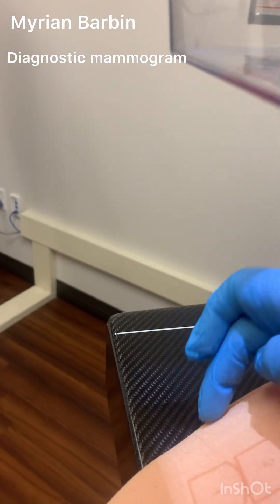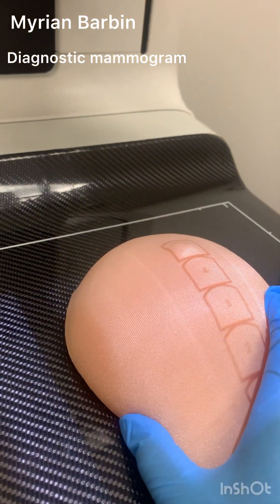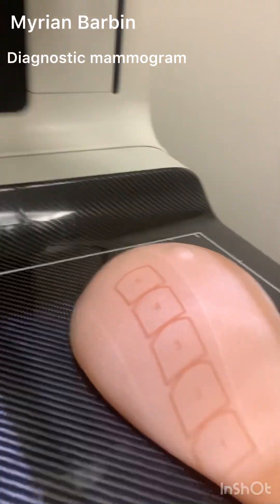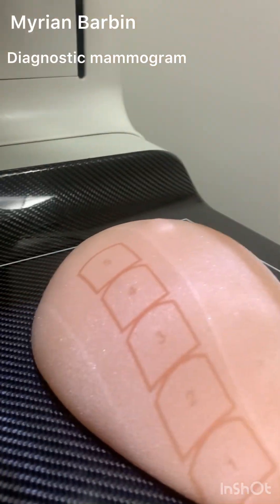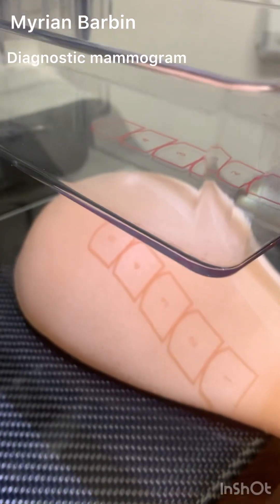So if you are looking at the breast, you are trying to find that abnormal tissue that was seen on the screening mammogram. This is done completely different from a screening mammogram — for this one, you are just looking at one section of the breast.